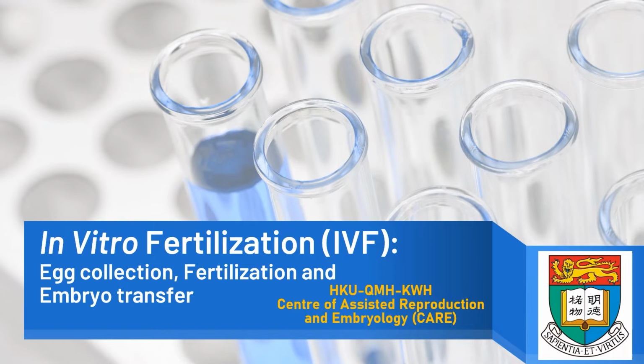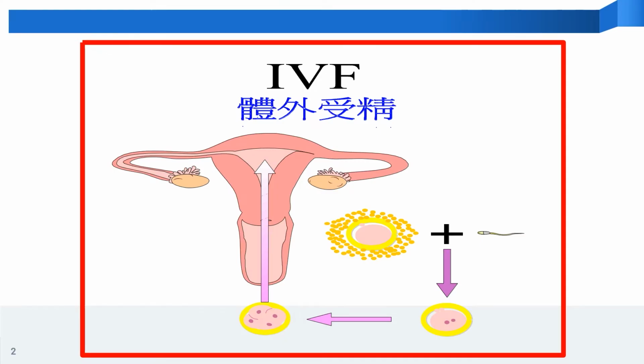In this video, I will cover the procedures of egg collection, fertilization, and embryo transfer. IVF refers to the medical procedure where the egg is fertilized by sperm outside the body, forming embryos, followed by transfer of the embryo back into the womb.